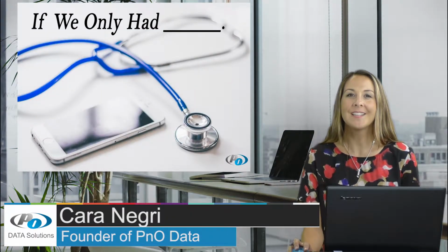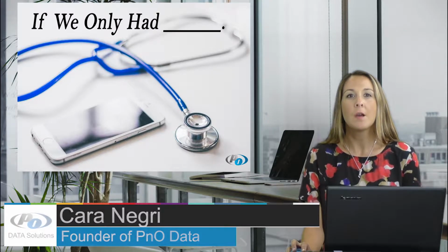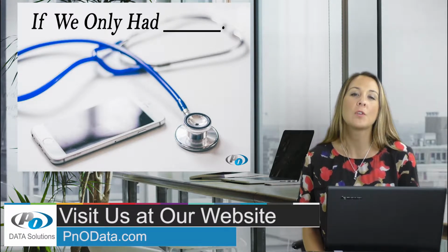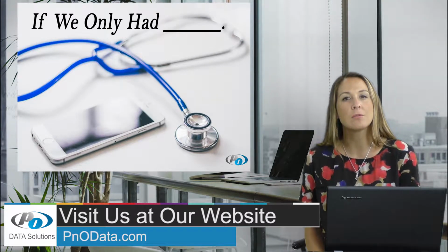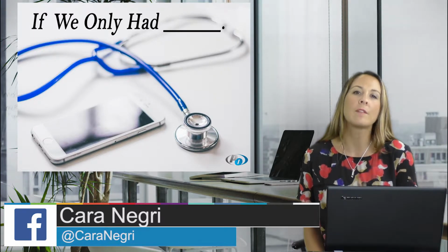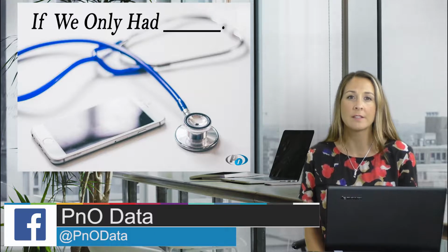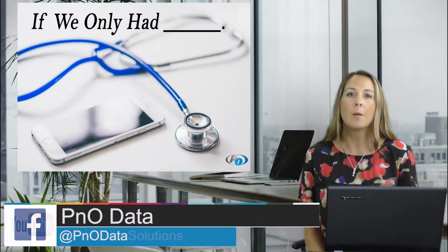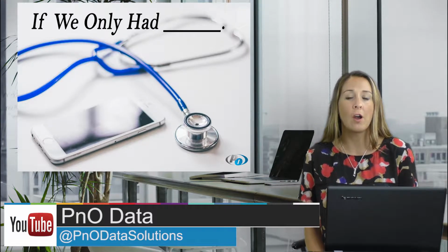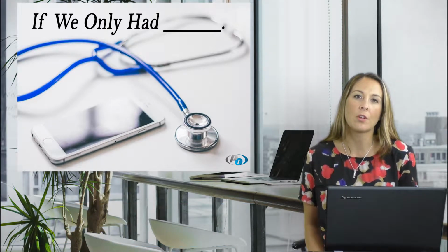Today we're going to go over desktop applications that can be used for two-dimensional motion analysis. If you've seen my other webinars, you've noticed that I typically talk about our mobile applications, which are really great for getting people into using 2D motion analysis in their practices, mostly because there's no cost to get started, and they're really easy to use on the go.